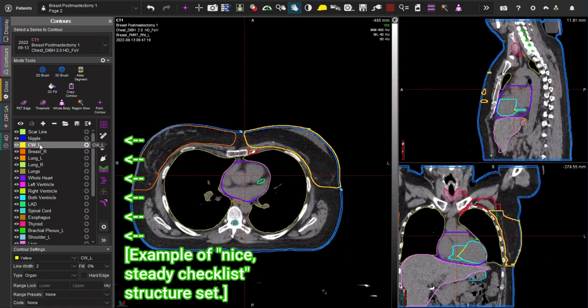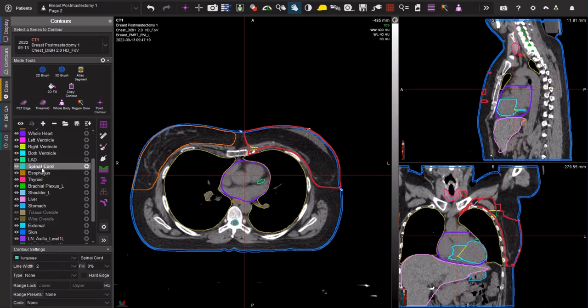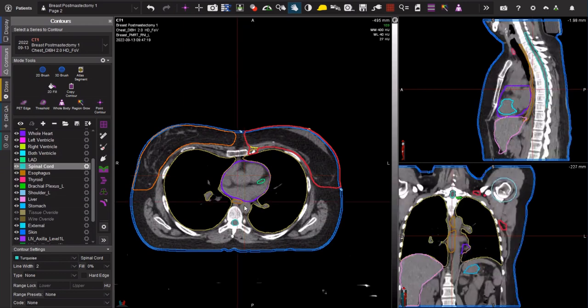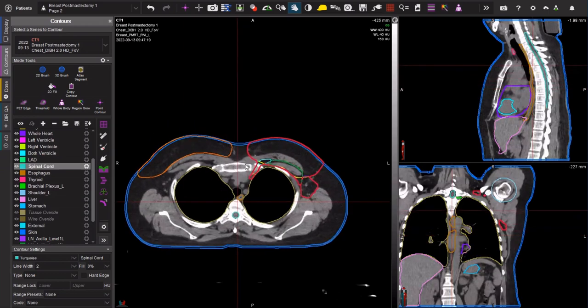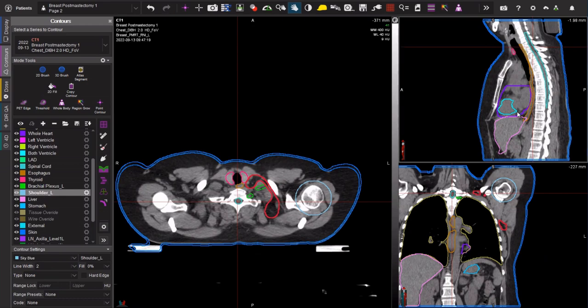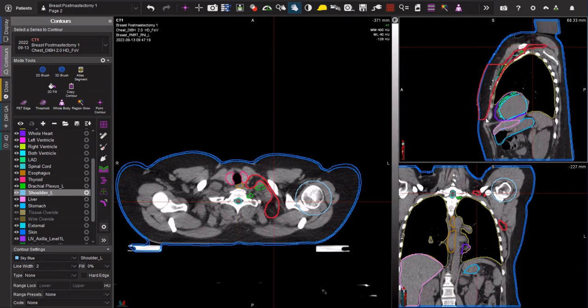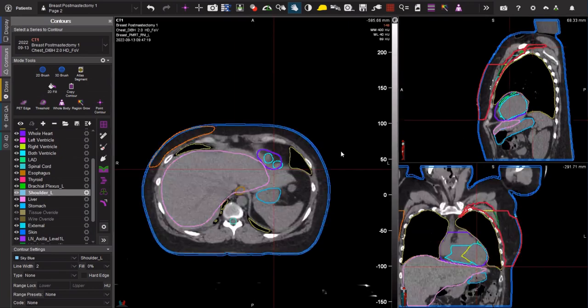I have my chest wall and contralateral breast contours next to each other. I have my lung contours together — individual and combined. I have my heart as well as heart substructures all bunched together. And then I have some of my midline OARs like the spinal cord, the esophagus, and the thyroid. Lastly I have some ipsilateral structures including the brachial plexus, the shoulder, and if the PTV goes down to the level of the liver or the stomach I will include those as OARs.